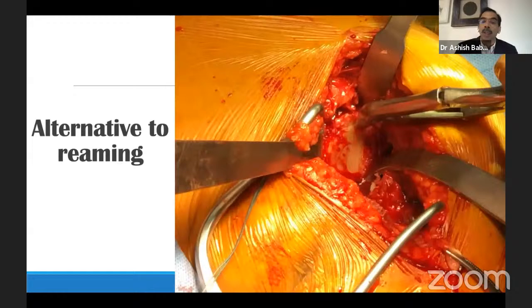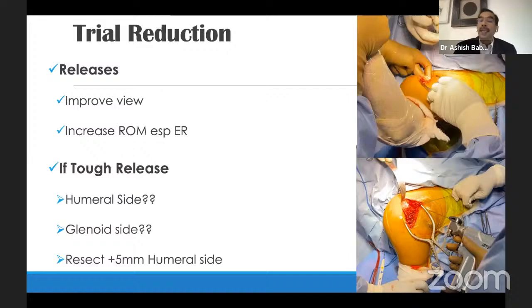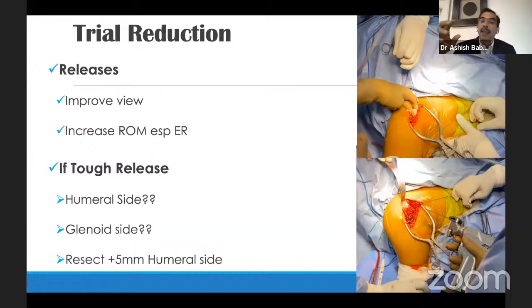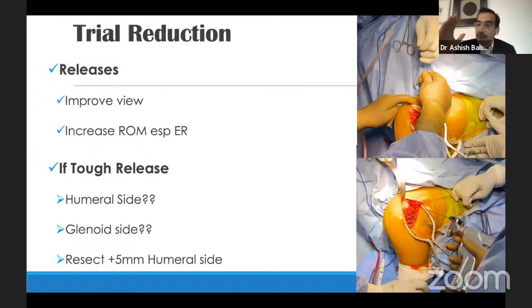So do you always need to do a trial reduction? I would say yes. So I have seen senior surgeons getting embarrassed because they put in the prosthesis and they couldn't reduce it. So it's risky. But once you get experience, then you can put in a prosthesis directly. But on the top video here, you see I'm struggling with that trial reduction. So it's too tight. And so I'm going to remove the proximal trial prosthesis and then go ahead and do some more releases. So what kind of releases do I do? So you best to do a humeral release on the medial side, and that's safer.